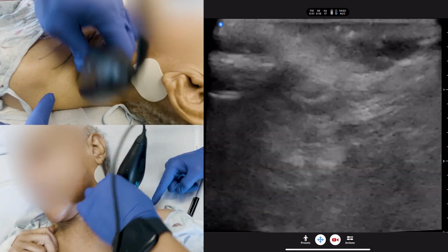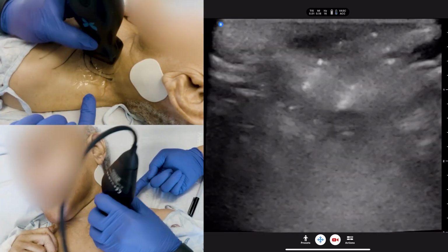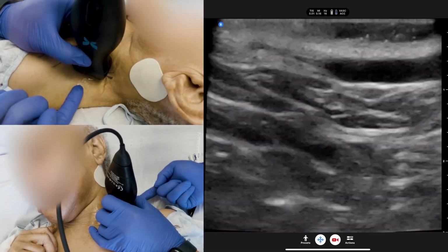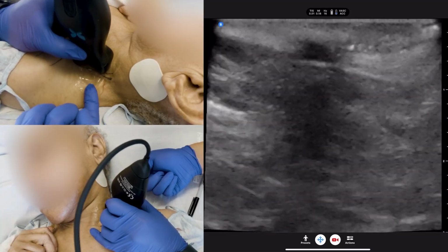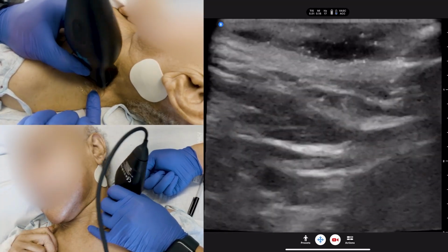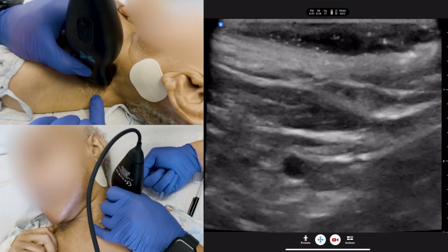So I just want to make sure that when I'm needling, because I'm going to needle this way, probably actually this way to give it a little bit more curvature. I'm going to needle this way. I'm going to go underneath and make sure I dip really deep and go underneath.